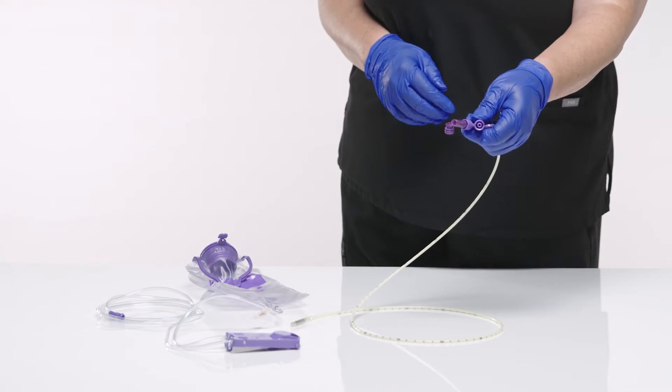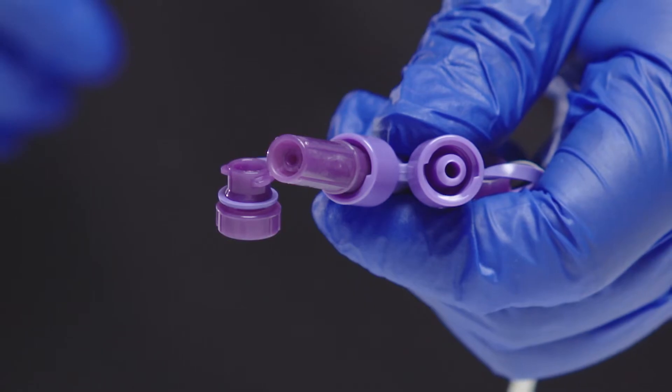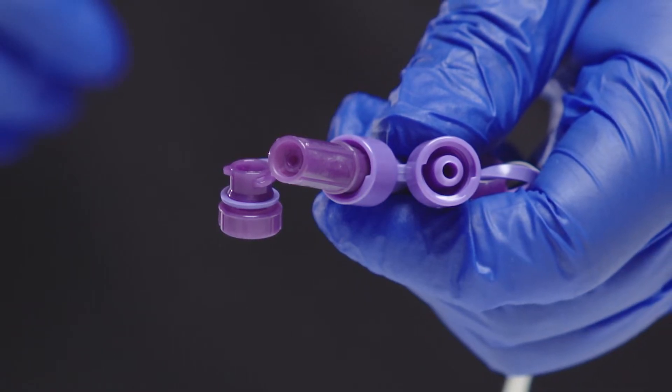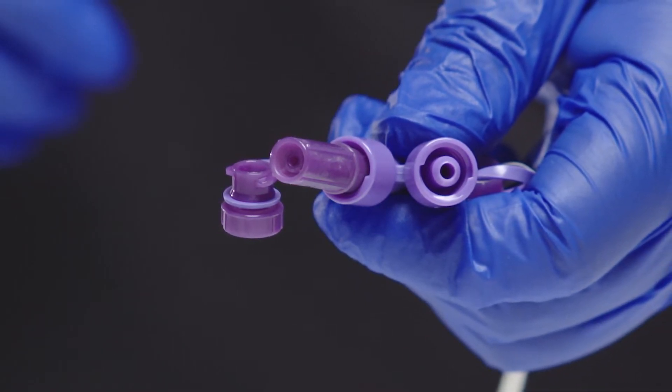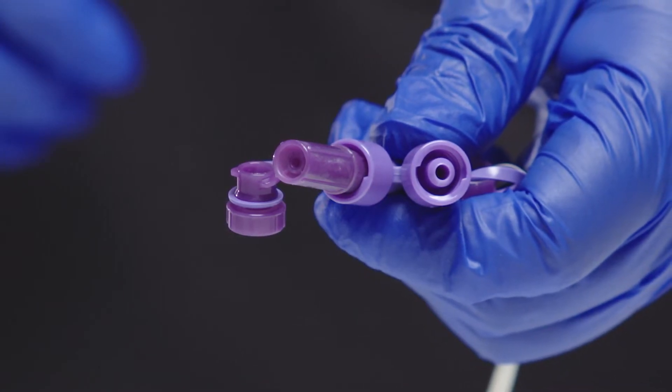Cardinal Health's Nasogastric Feeding Tubes now come with Enfit connections. Enfit is a reverse-luer lock connection designed to increase patient safety by reducing the risk of misconnections. This addition supports a safe method for providing nutrition, medication, and fluids to a patient.